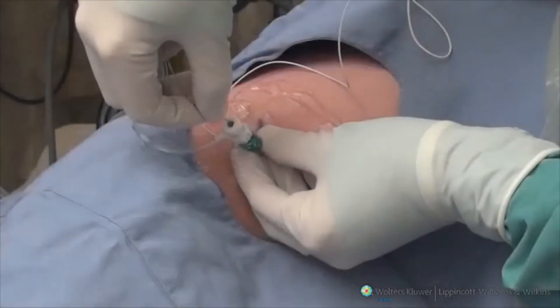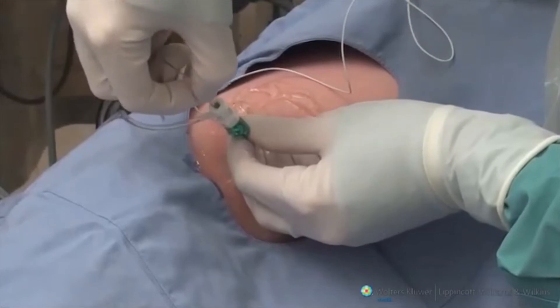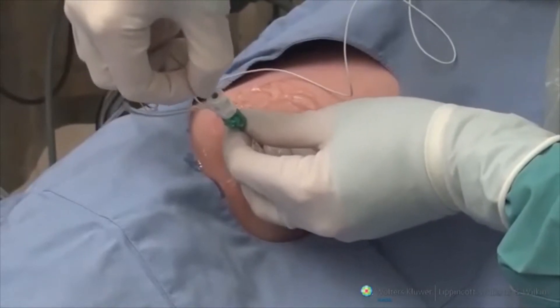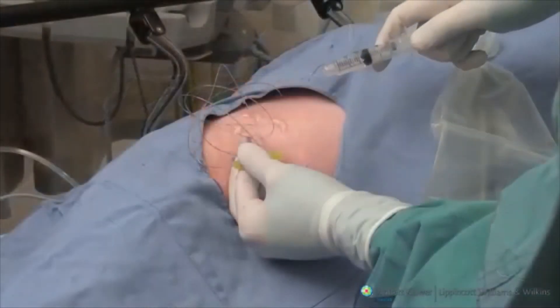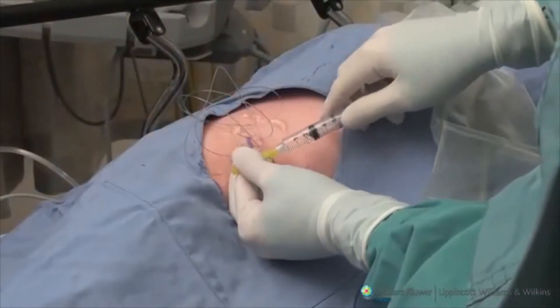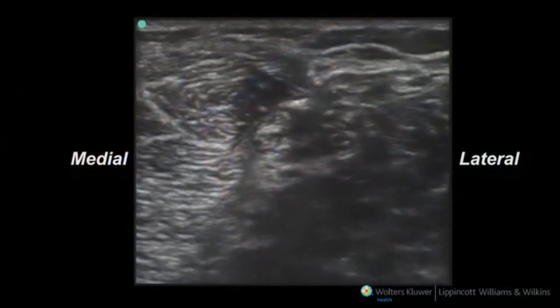A catheter can be threaded through the needle while the tip is still between the peroneal and tibial nerves. It is advisable to advance the catheter further while the needle is slowly being withdrawn. Catheter tip position can be confirmed by injecting through it and observing spread of solution under ultrasound guidance.